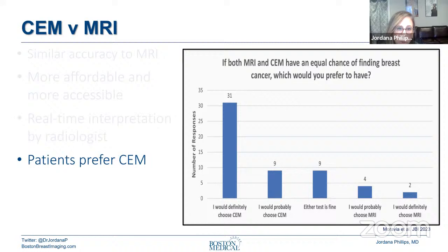Patients also prefer contrast-enhanced mammo. This was a study that we recently published. These are women who have a history of breast cancer, and we asked them, if both MRI and contrast mammo have an equal chance of finding your breast cancer, which would you prefer? And you can see that a far majority, 73%, hopefully you like my annotations, actually would prefer CEM. Only 10% preferred MRI.